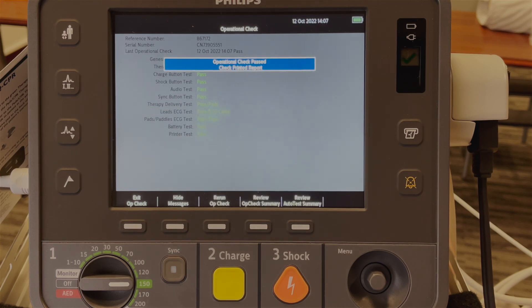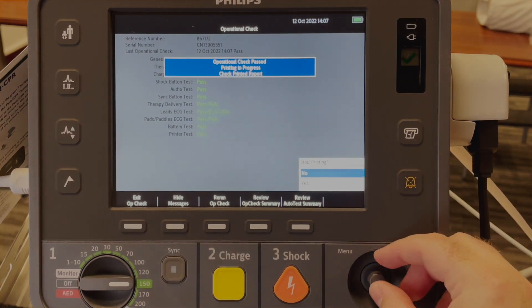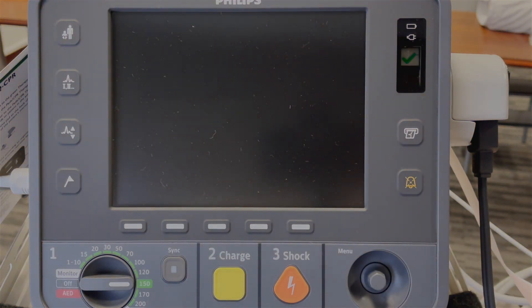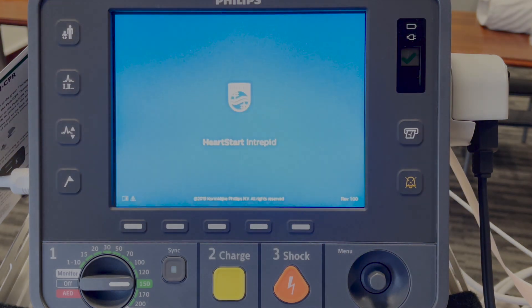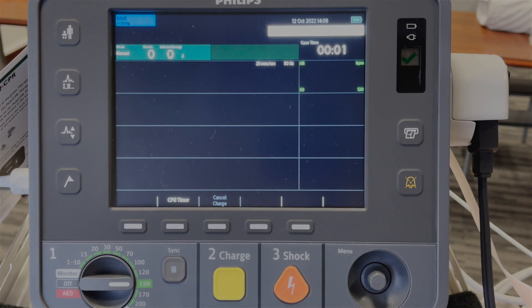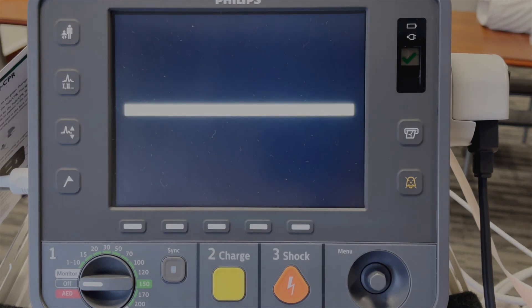It tells me 'Operational check pass.' At this point we can click 'Exit operational check.' It asks me to stop printing — for this purpose I will say yes and the device will reboot back into clinical mode. Next step, switch off the device and the device is ready for patient care.